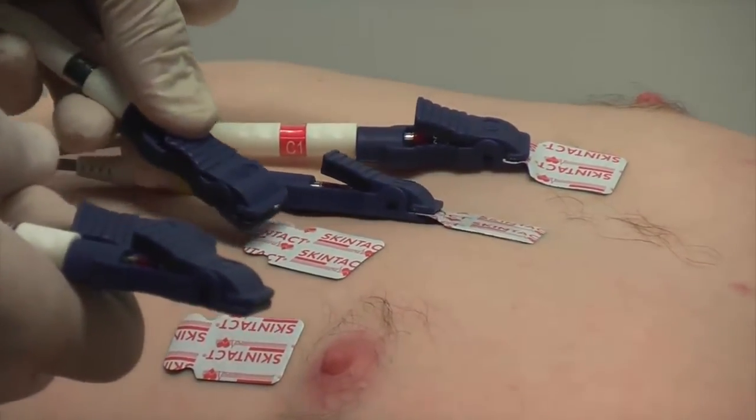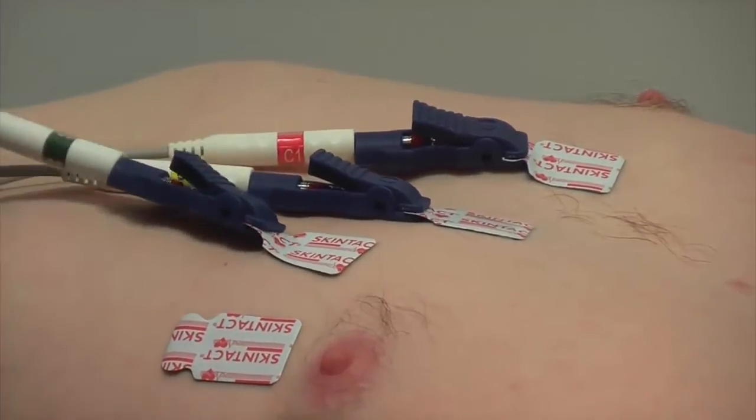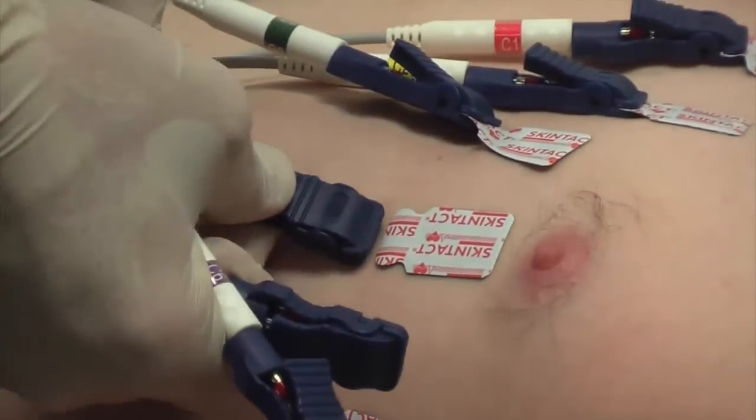The flat side of the alligator clip should be in contact with the patient, not the other way around.